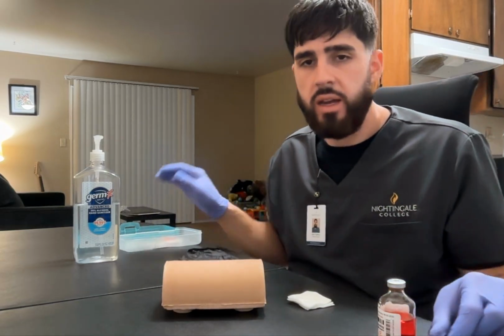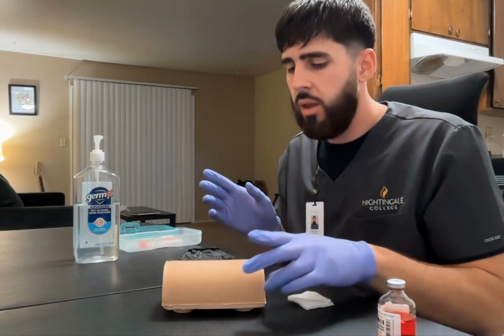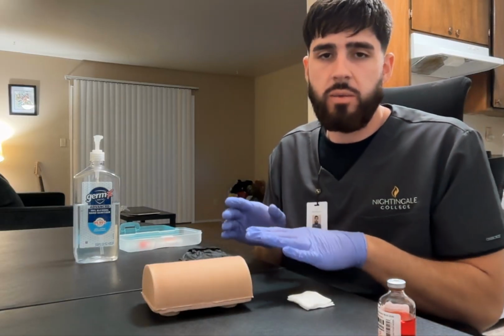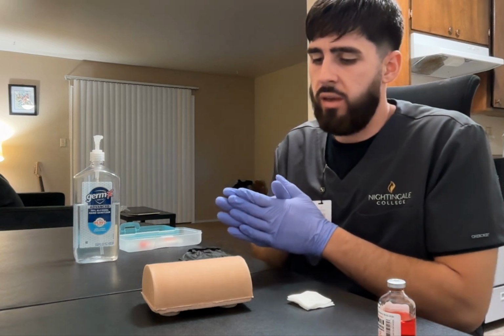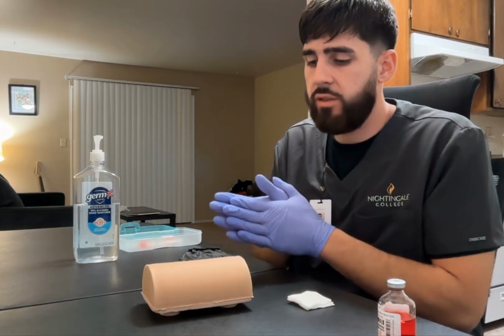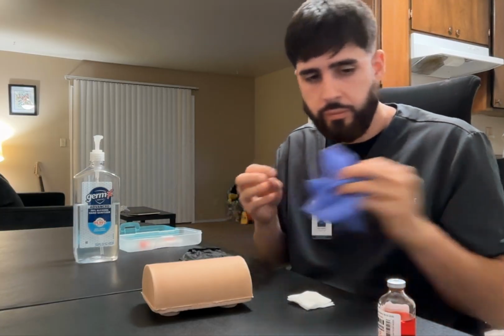I threw away my syringe without recapping it, which is the correct way to do it. I have now injected the medication. I see the bleb. I'm checking for any immediate adverse effects. I can now remove my gloves, throw those away, perform hand hygiene.